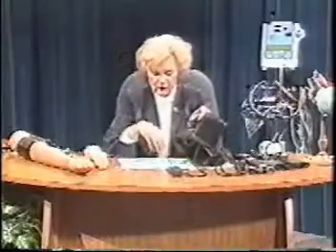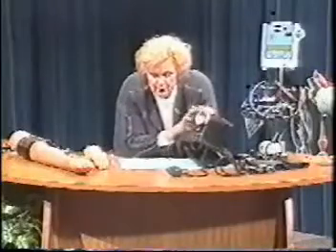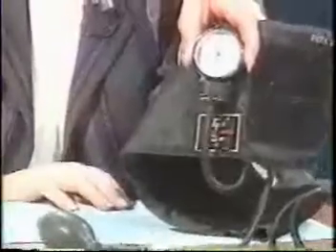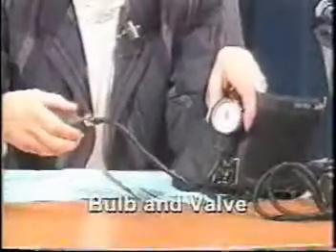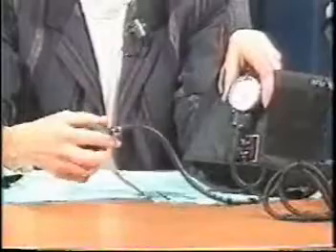There are 2 tubes on the cuff. One of the tubes is connected to the pressure control bulb and the bladder inside, and that's this particular one. This is the pressure control valve. And the other tube is connected to this pressure gauge that you see. The bulb and the valve at the very bottom of this sphygmomanometer is used to pump air into the bladder of the cuff and control the release of air from the bladder. And I'm not talking urinary bladder, we're talking about the balloon or bladder that's within the cuff of the blood pressure cuff.